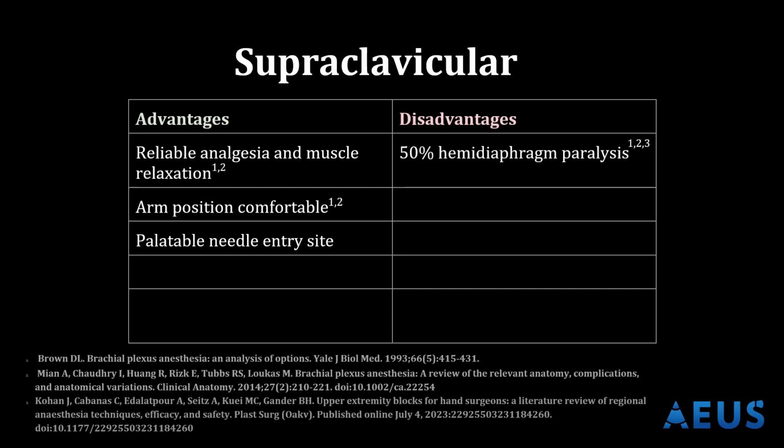There is a 50% risk of hemidiaphragmatic paralysis, which will not be tolerated in this patient. There now is a small risk of vascular puncture because we're approaching near an artery. And we do bear some risk of pneumothorax since we'll be working above the first rib.